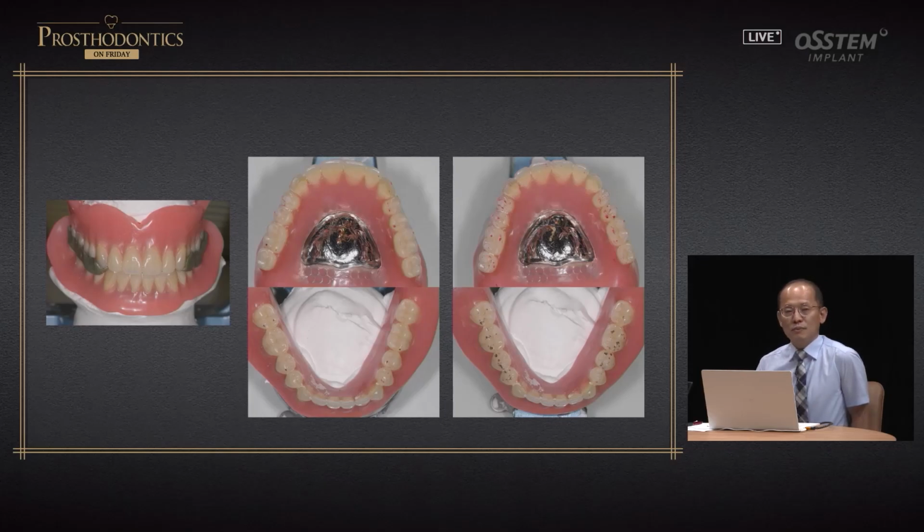So clinical remounting, if you do it frequently, you become more confident about the result, and patient would have synchronicity and become easier in terms of chewing. So clinical remounting in the beginning, it might not be easy to do, but once you gain experience, you become confident in your skill. So I strongly recommend it.